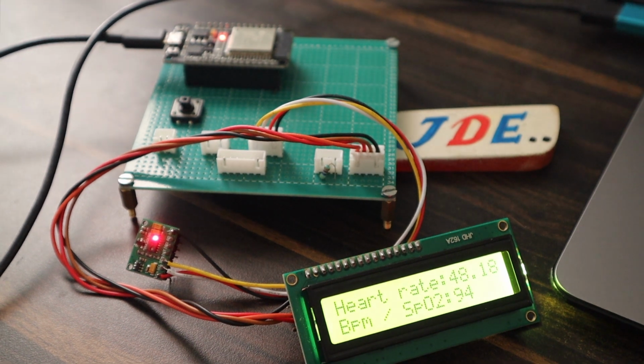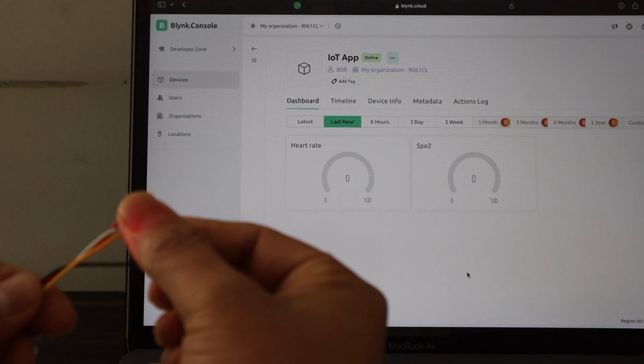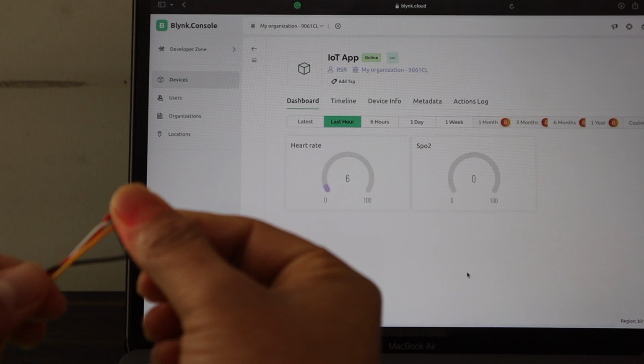Now test with the Blynk app. I put my finger on this MAX30100 sensor, and after a few seconds it takes the reading and displays the proper reading in the Blynk app.